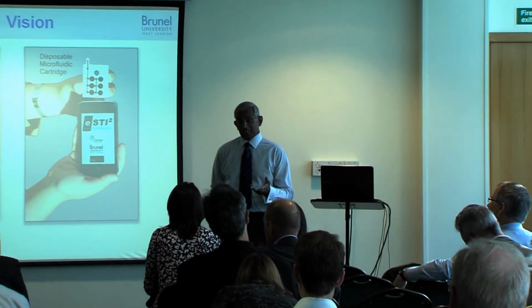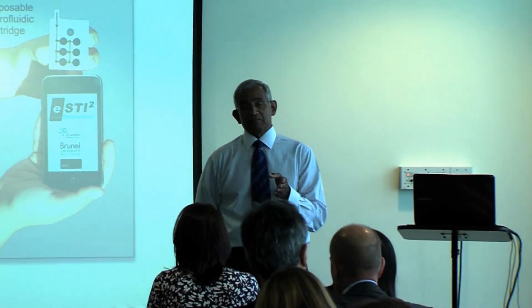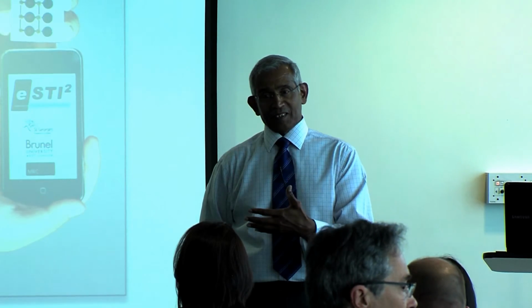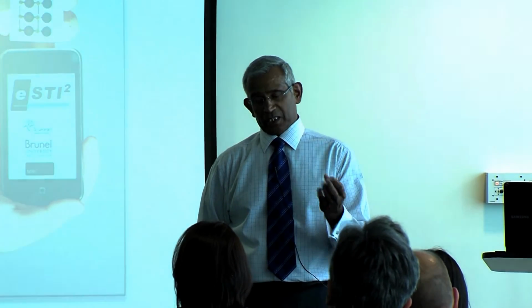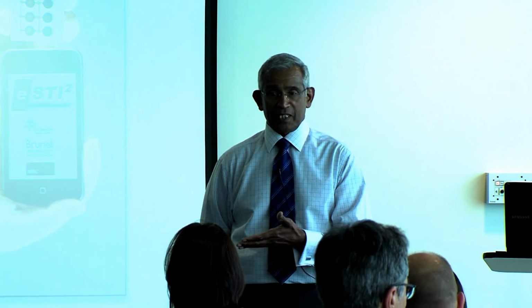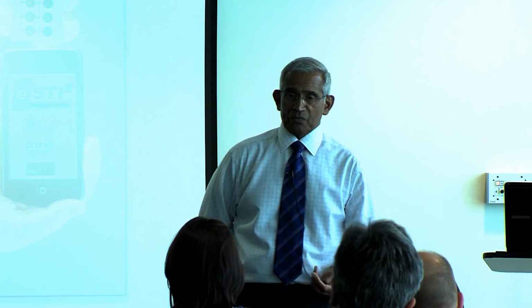Yes, you need to use the standard technique to make sure that the quality of the DNA is right. What you do is that the extracted DNA is then put through the benchtop equipment that's already out there to measure the quality of the DNA. Okay, so there is commercial equipment. Oh yes.